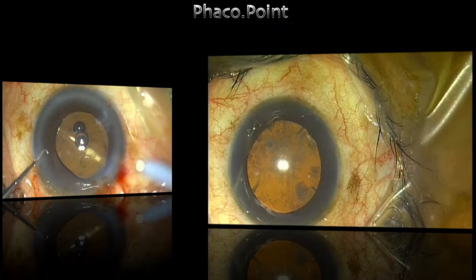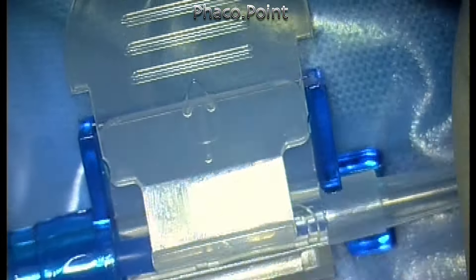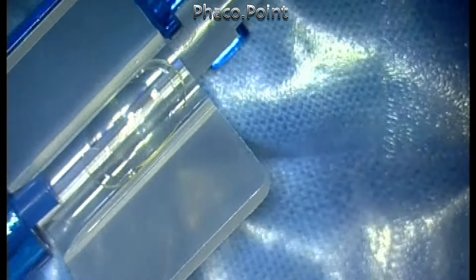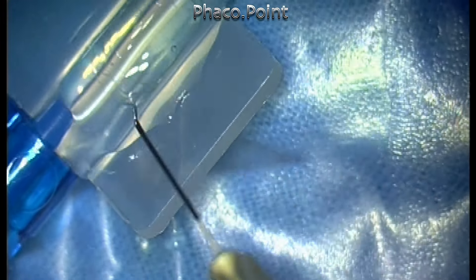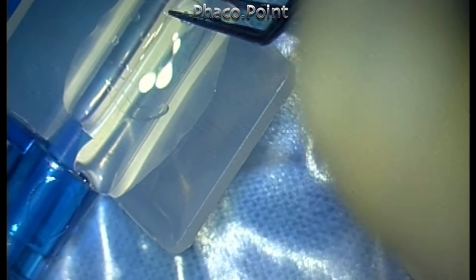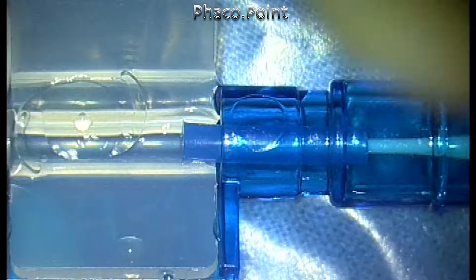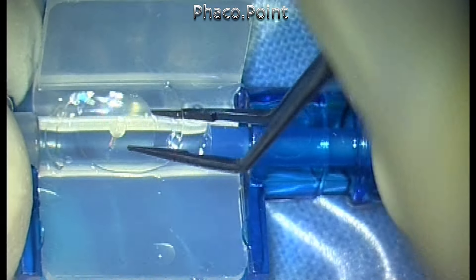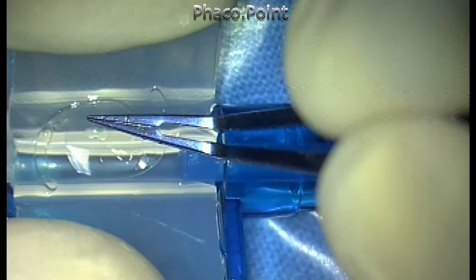The actual solution is illustrated in this third case. When using these indigenous lenses, they come prepackaged in a dry state. Because hydrophobic lenses dry up, they tend to get stuck to the cartridge. I did not see this problem with other types of preloaded lenses like the Zeiss lenses or others I have used — it seems to be an exclusive problem with the hydrophobic acrylic indigenous lenses packaged dry.